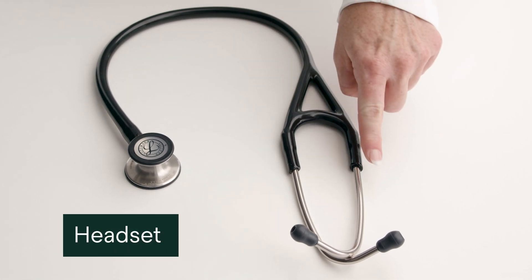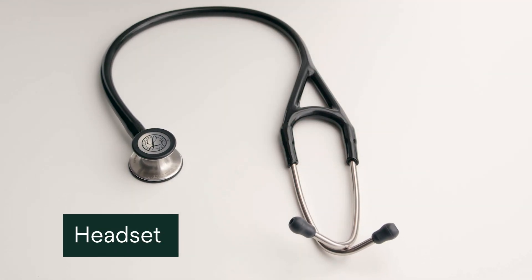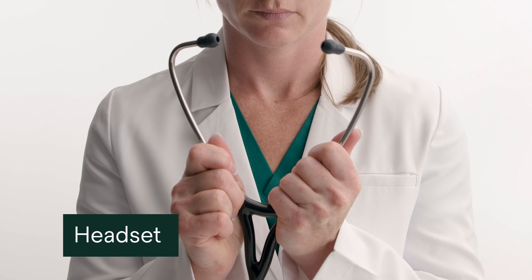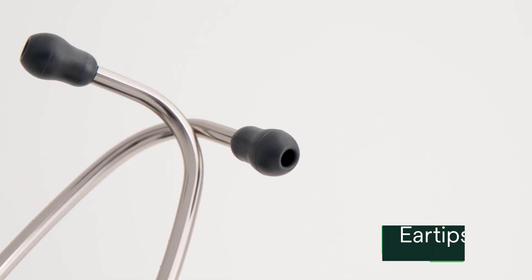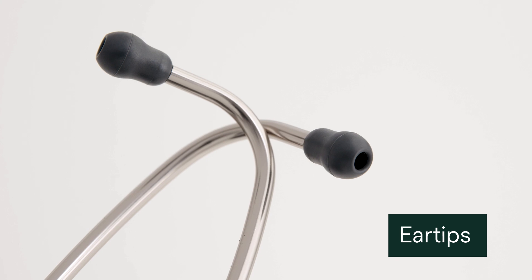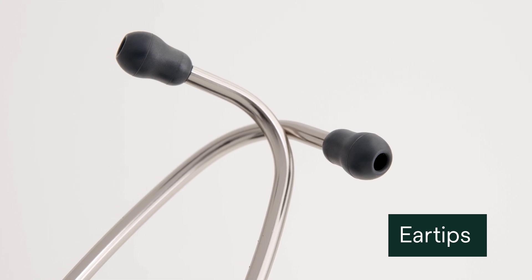The headset is made up of two ear tubes, the yoke, and the ear tips. It's adjustable to ensure a proper fit into your ear canals. The soft sealing ear tips are designed to fit snugly and seal out ambient noise to help you focus on auscultation.